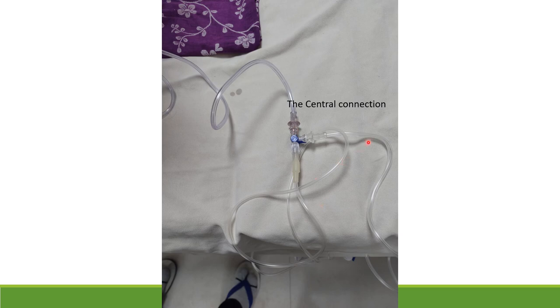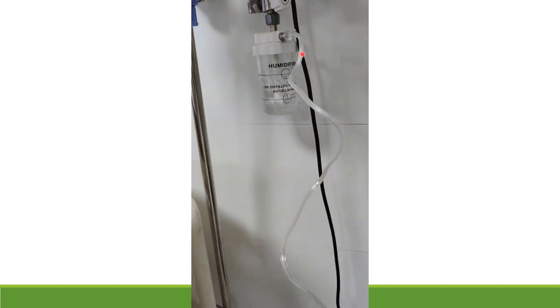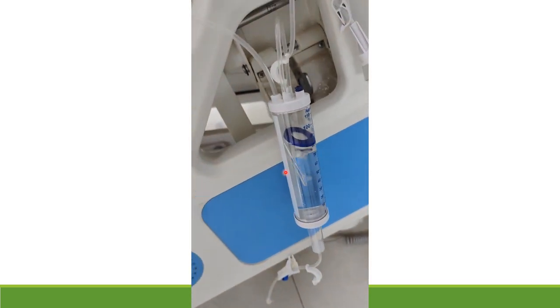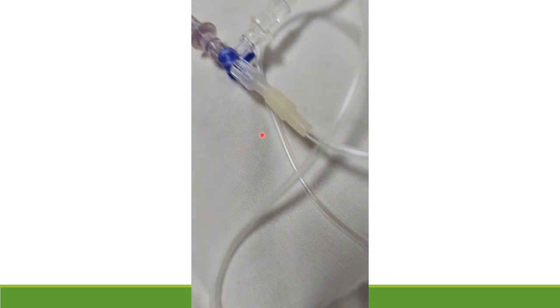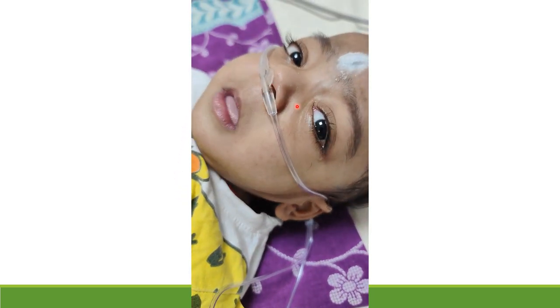This is the central arrangement: this portion is the oxygen pipe, the other end of which is connected to the oxygen source; this portion is the nasal cannula side, the other end of which is connected to the patient; and this is the IV pipe cut from the pedi chamber, the other end of which has been dipped inside the pedi chamber. The pipe coming from the oxygen source goes in and bubbles, and from the three-way connection the nasal cannula is connected to the patient.